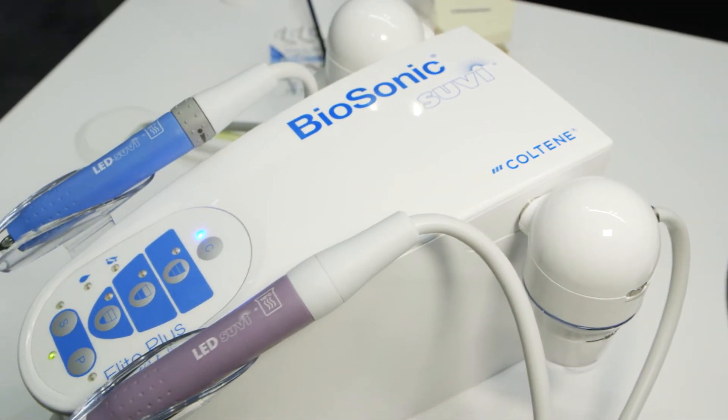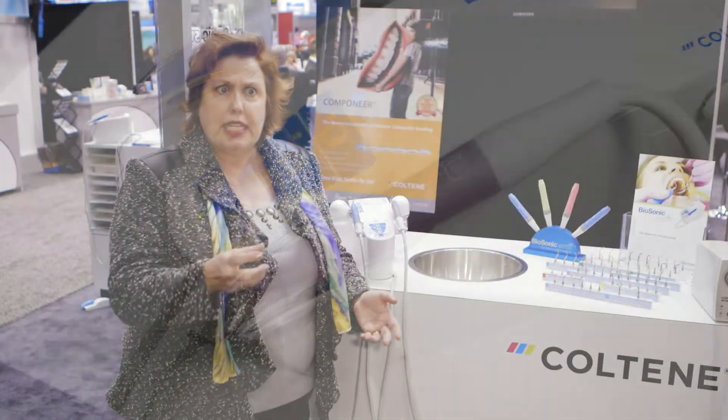The number one thing is that they built this unit based on input from dental hygienists. The handpieces are thick and easily ergonomic.